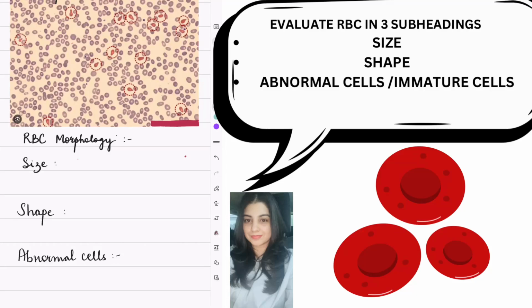So this is a peripheral smear, and I will say this is our case 1, because different peripheral smears we'll be studying over a period of time, and we'll try to decipher how it goes. Without knowing the diagnosis, we'll go forward, so that we try to learn to identify them. In clinical practice, nobody tells you what it's gonna be. You are the one who's responsible to diagnose it and give the clinician a clue whether you are thinking about thalassemia, or iron deficiency anemia, or megaloblastic anemia. So the peripheral smear picture is very important.